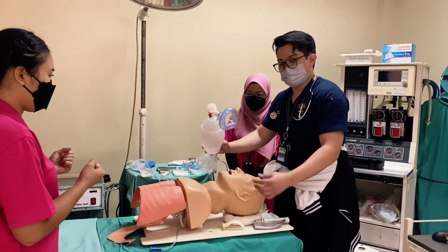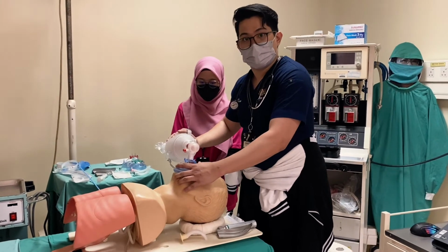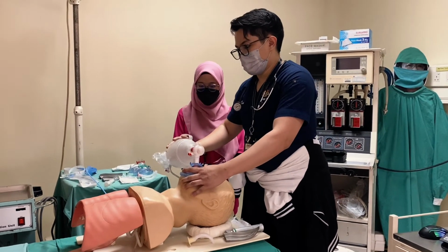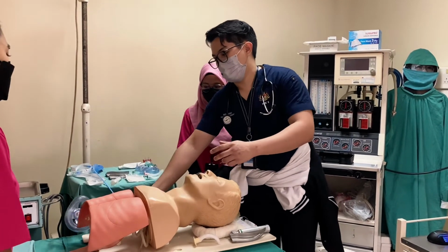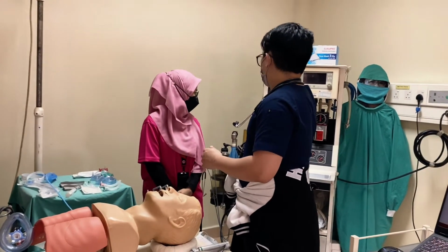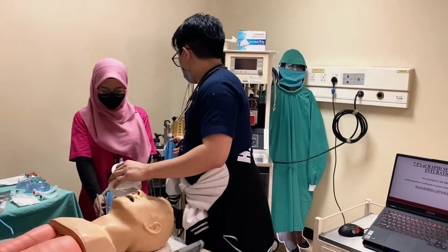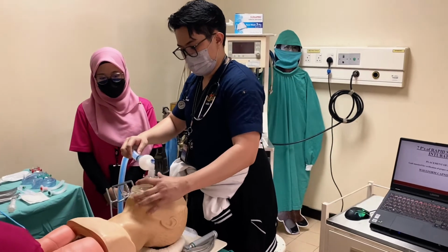our bag valve mask, just in case we need to give pre-oxygenation again if the patient desaturates. Certain places may have the bag valve mask; for the anesthesia department, they will have a GA machine. For instance, this is one of the examples, where we have one person to provide ventilation from here to here. We ask him.